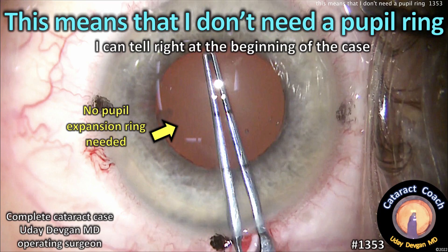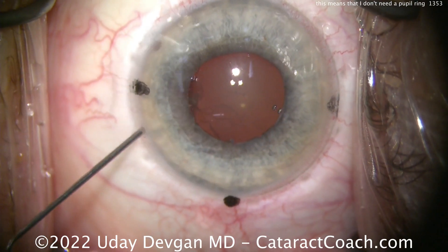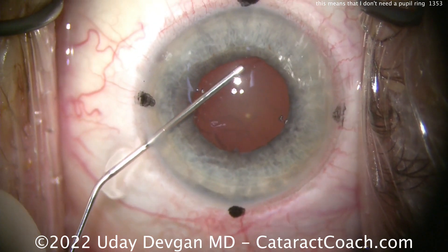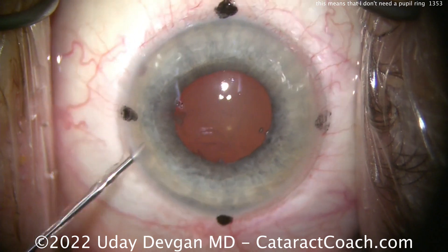CataractCoach.com. This sign means that I do not need a pupil ring, and I can tell right at the beginning of the case. I'm going to show you a complete cataract case. If you don't have six minutes of time to spend here, find it on the YouTube channel. But let's watch this case here.